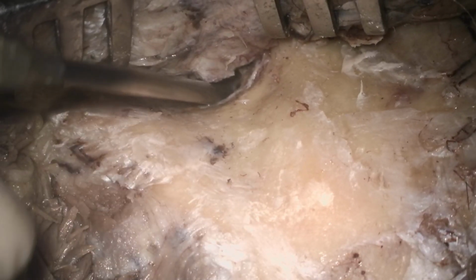But in our case, when we do a cortical mastoidectomy for a COM or an infected case in day-to-day practice, whether we need to do a larger mastoidectomy or not, this is a very important question. Every day we are asked by our student colleagues and everywhere: during a COM surgery, do we need to do a wide cortical mastoidectomy, or do we open just up to the mastoid antrum?